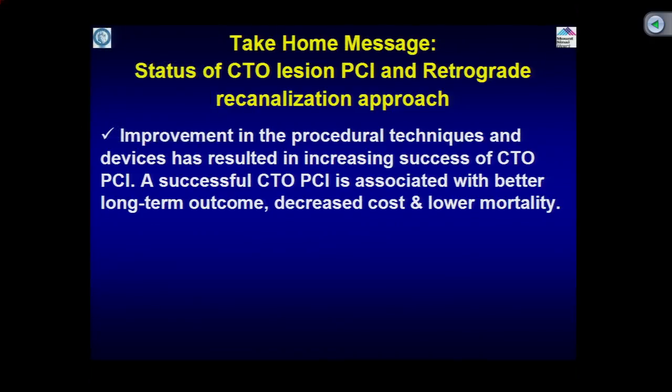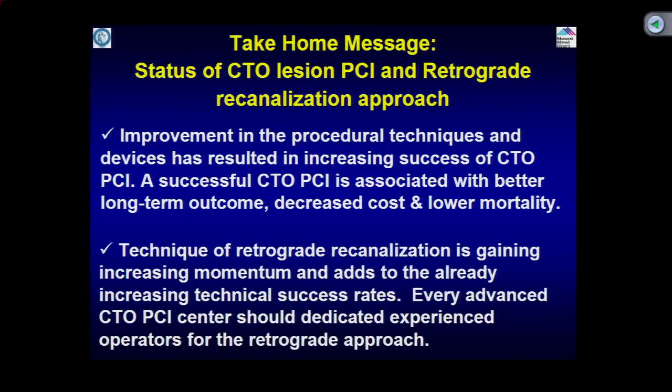So this is basically the take-home message of today's case, the status of the CTO lesion PCI and retrograde recanalization approach. Improvement in the procedural technique and devices has resulted in increasing success of CTO PCI. A successful CTO PCI is associated with better long-term outcome, decreased cost and lower mortality. Second, the technique of retrograde recanalization is gaining increasing momentum and adds to the already increasing technical success rates. Every advanced CTO PCI center should have a dedicated experienced operator for the retrograde approach.